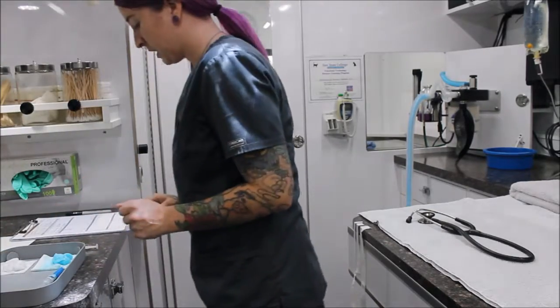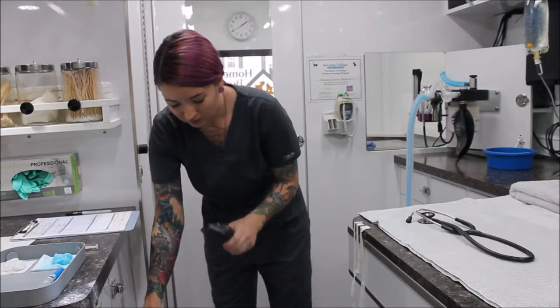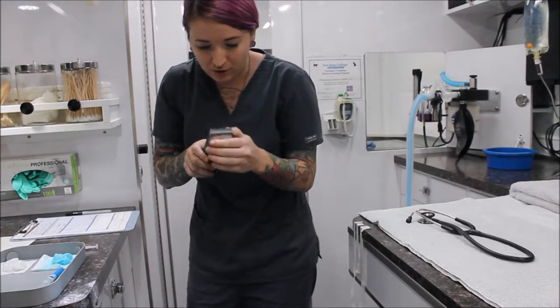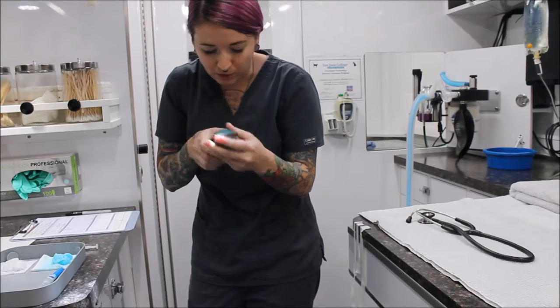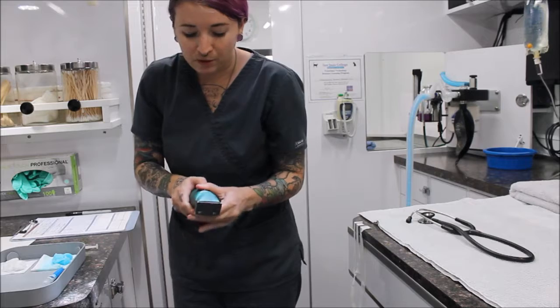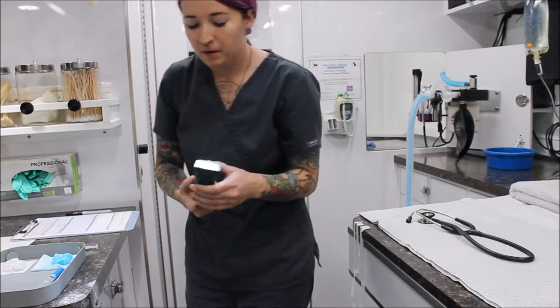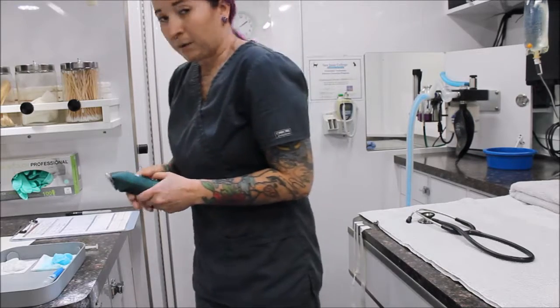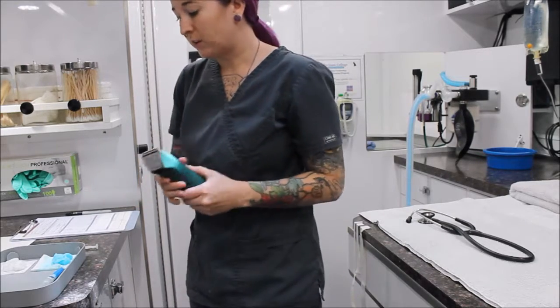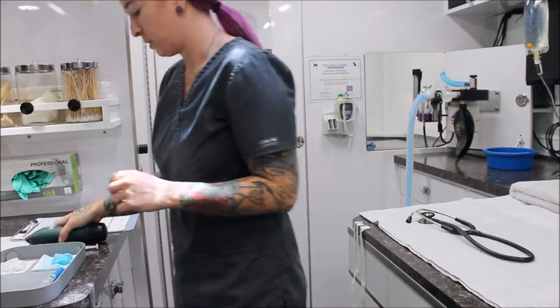So now the next thing I'm going to do is get my clippers, and I'm just going to look at them, make sure they look clean. I don't see any debris or blood or anything on there, so that's good. And I'm also going to double check to make sure they are currently working and the battery is not low on them, because that happens, and we would not like that when we're shaving a leg for a catheter. So I have confirmed that, and it has a 40 blade on it, which is appropriate size.